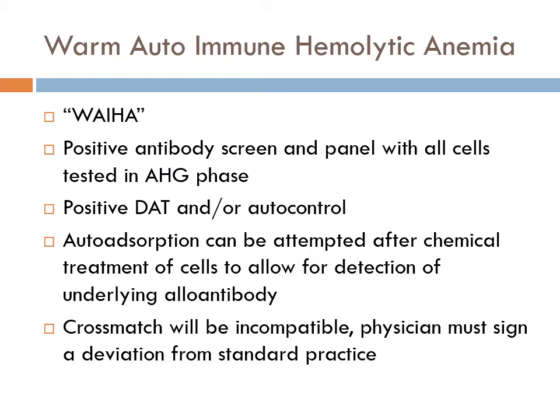Autoadsorptions may be attempted after chemical treatment of the cells to allow for detection of an underlying alloantibody. A little bit on this because we don't get a whole lot into this even in lab portions of it. With an autoadsorption, that's the person's own red cells. We're going to try to attach things to the patient's red cells to remove the interference from that plasma.